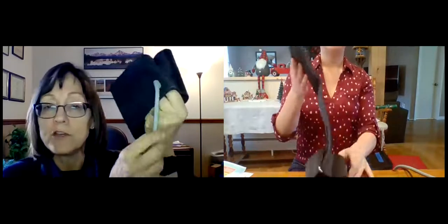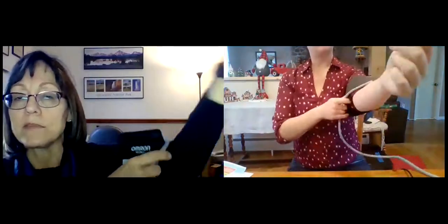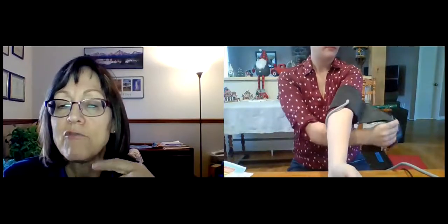So we're going to just undo the Velcro, and you're going to slip the monitor on. So this little tube is coming out just above your elbow. So we're going to slip it on your arm. And then you've got to cinch up that Velcro. So this way? Well, that's upside down. Remember, we want to try and get the tube right over where your elbow bends. Oh, so this way. Ah, now you've got it. Okay, now try and get a nice snug wrap with the Velcro. And this takes a little practice, so don't be afraid to practice a little bit.